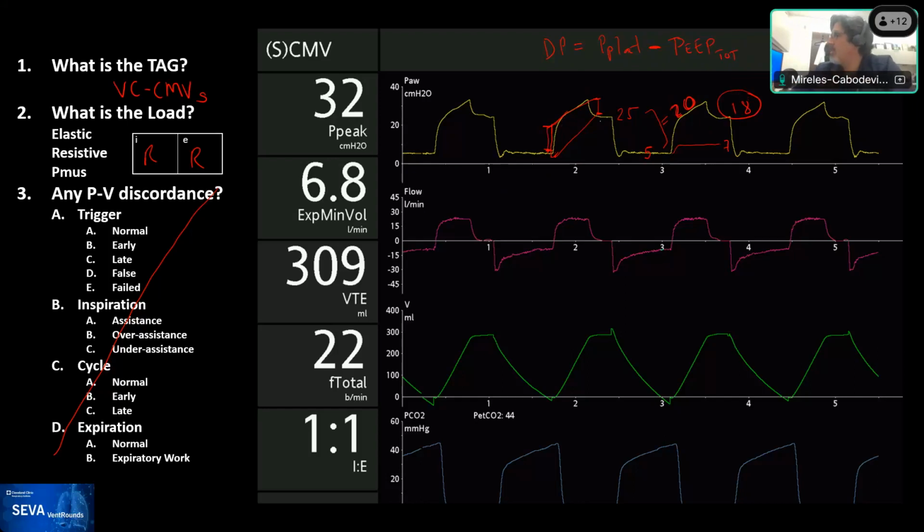Yeah, so the comments start coming in. They're talking about, well, is it to overcome auto PEEP, or is it a decrease in dynamic airway collapse, recruitment of small airways? So we're close to the concept. You recognize the increased resistive load, and that probably is where part of the concept lies, but it's not exclusive to increased resistance. This also happens in other conditions.